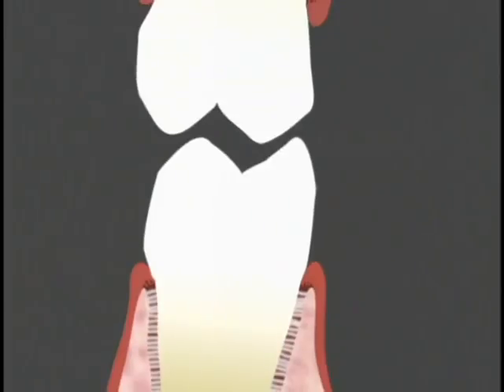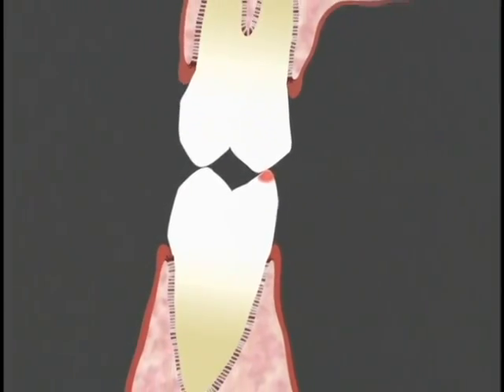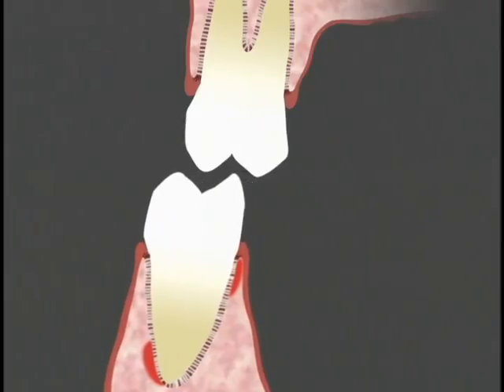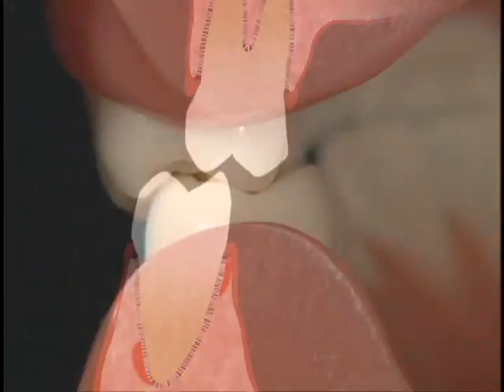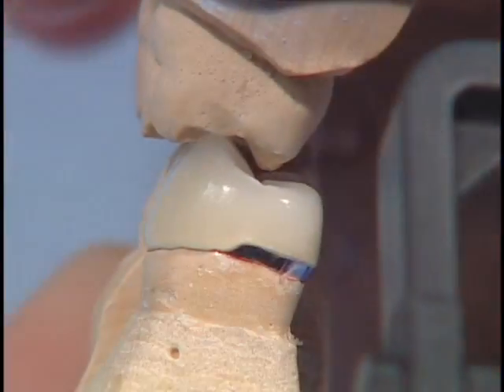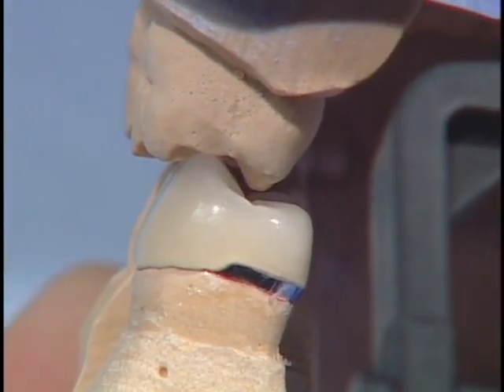Making a shear cusp too long causes occlusal interferences. That is, as the jaws are moved in lateral excursions, these long shear cusps receive excessive lateral stresses from the opposing dentition, damaging the periodontal tissue and lamina dura. Remember, posterior teeth can withstand forces that are along the long axis of the tooth, but will be damaged by lateral forces. On the other hand, stamp cusps are never too long because they always have opposing dentition that limits their dimension. If a stamp cusp is too long, you won't even be able to close an articulated model.